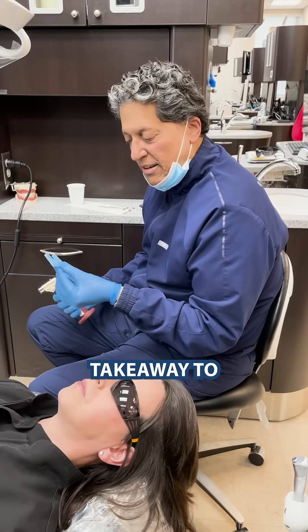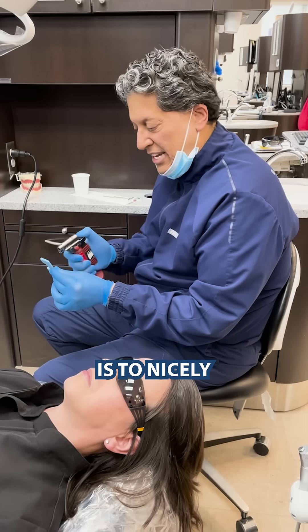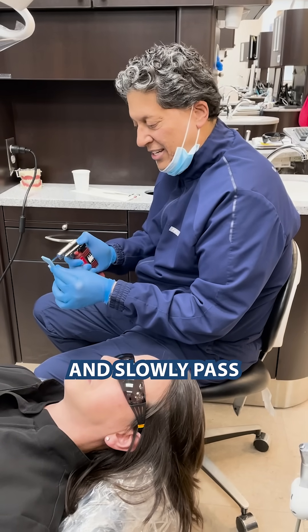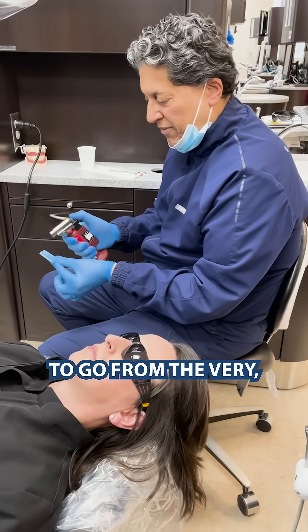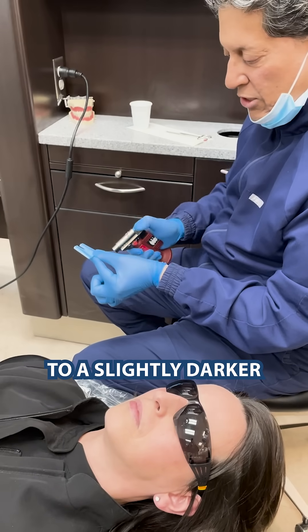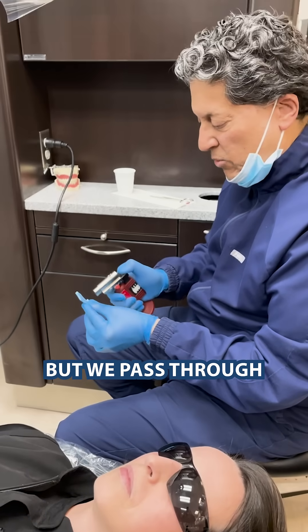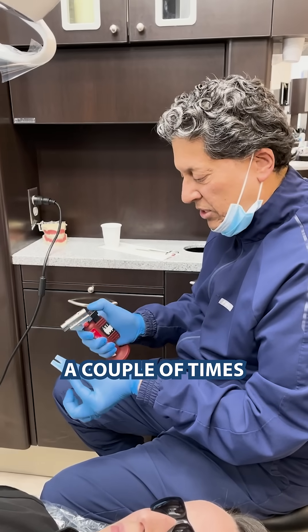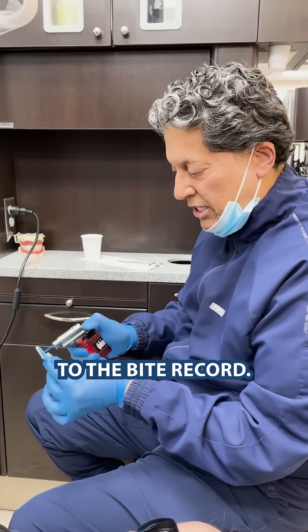One key takeaway to heating a bite record properly is to nicely and slowly pass the blazer torch through the material, going from a very light blue to a slightly darker blue. Remember, we don't want this to be molten — we pass through a couple of times to introduce the heat to the bite record.